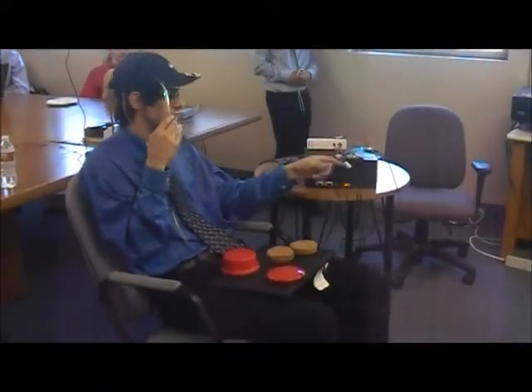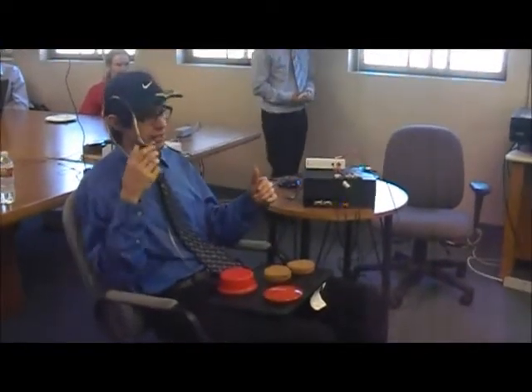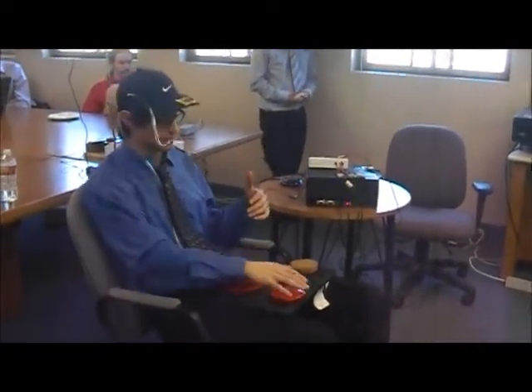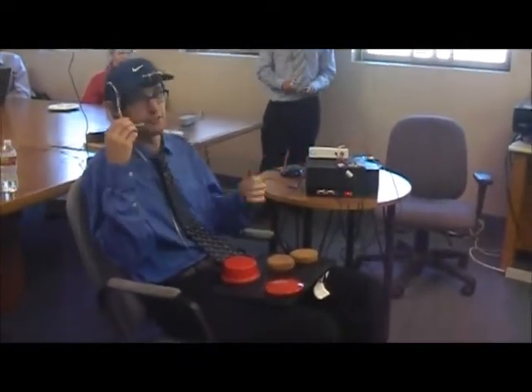You can easily switch any of the sensors and switches around, so someone who actually has some arm movement can use a large push button like this to bowl with it, and they don't have to use the puff sensor.